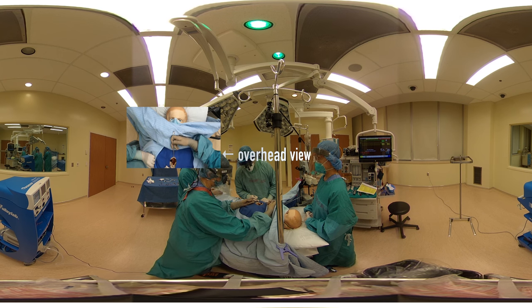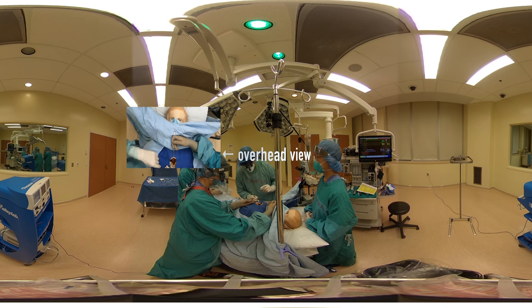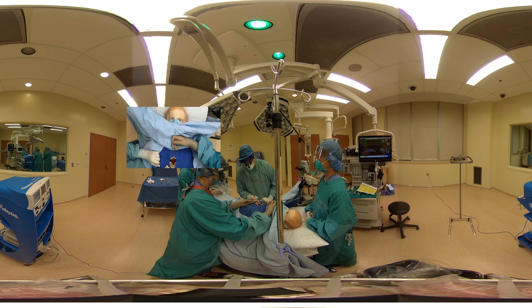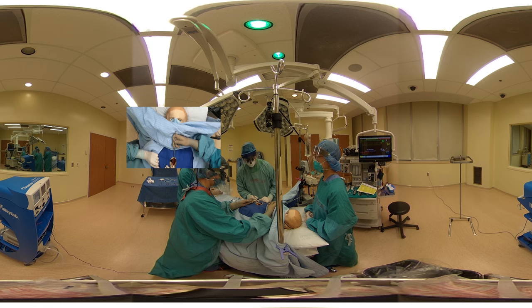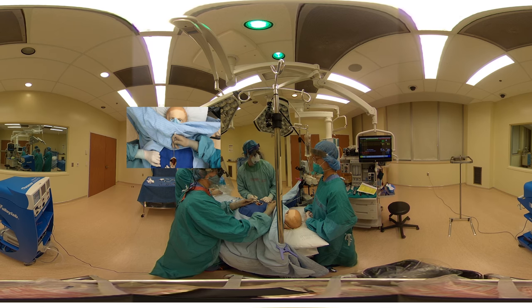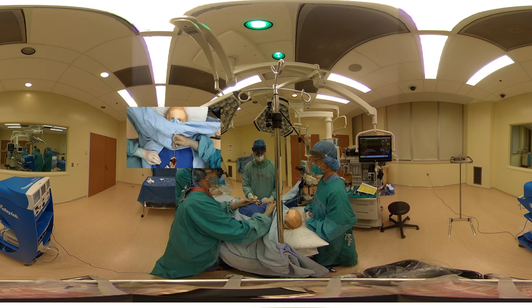So we've finished our dissection and we have the trachea exposed. I have some concerns — this is a bit of a deep neck, maybe some abnormal anatomy here. I could foresee that potentially putting the tube in could be challenging. I wouldn't feel comfortable doing it with a paralyzed patient, so I think we should keep the patient breathing spontaneously. Sounds good. Shall we move to Plan B? Yeah, let's do that.